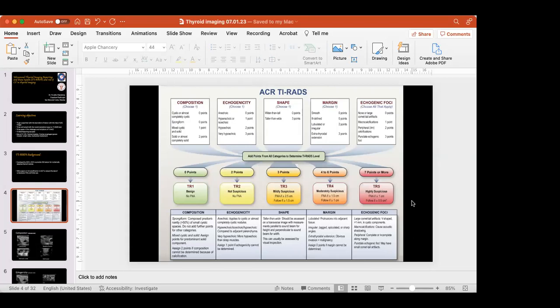Yeah. If it's a large nodule, obviously, you can always do that clinically and surgically. But if it's for smaller nodules, which most of the nodules are, you would need to target the right area. If a nodule is mixed solid cystic, you should not end up targeting the cystic component. You need to target the solid part. So for that, you'll need direct visualization on ultrasonography. Exactly. So I think, like Dr. Nivedita said, it is better, if possible, to go ahead with a USG guided FNA whenever possible, in the same sitting when you are doing an ultrasound.